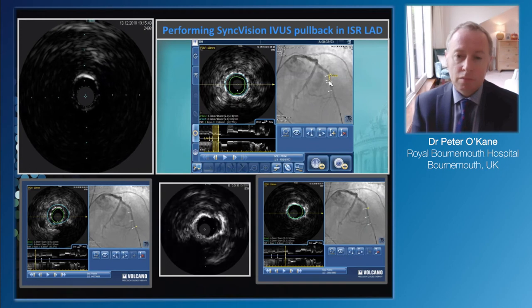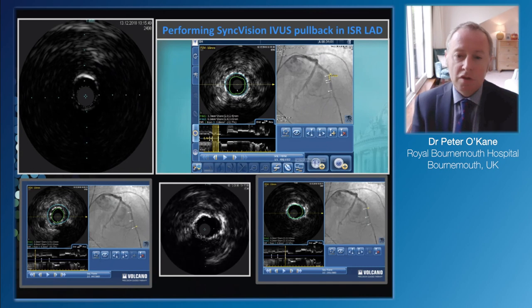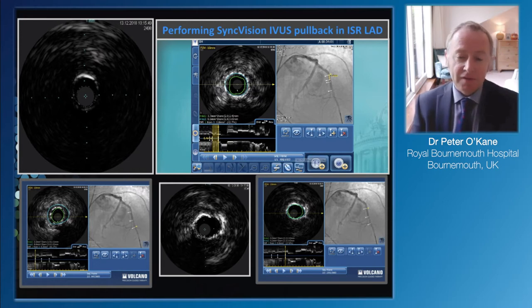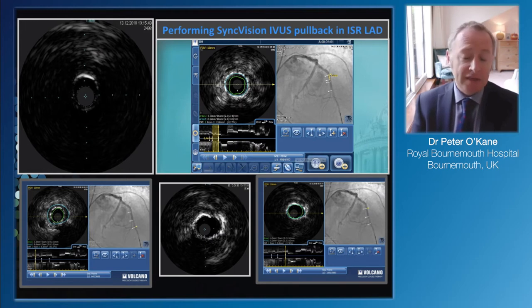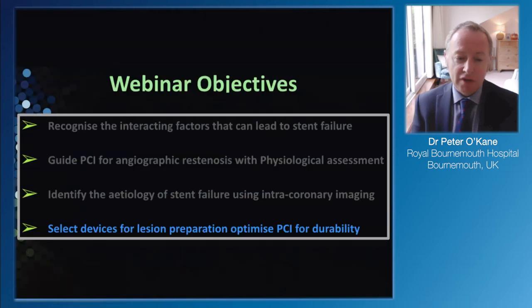I think that's where we can apply our laser. While we do some more measurements, we can turn on the laser machine and boot up to show you the laser setup. As you can see, the benefit of this system is that the pressure wire suggested a very significant lesion where we see the angiogram is very tight. But often in stent failure there are multiple mechanisms at play - not only neointimal hyperplasia here, but also proximal to that lesion there is under-expanded stent. That may be part of the changing flow dynamics that led to the problem further downstream. Imaging really is crucial and has helped us here.